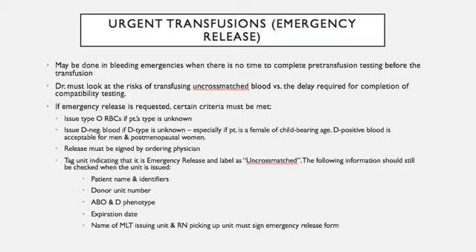And I will just take a second to say most blood bank facilities now have automated instruments that you can put the sample on. It'll determine the patient's ABO and RH. It'll do cross-matching. It'll do the antibody screen, which is very nice, because you can put that sample on and then walk away and do something else. But most of the time that takes longer than doing the testing on the bench.